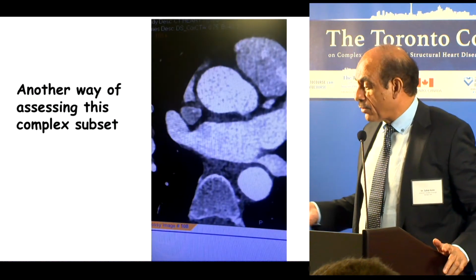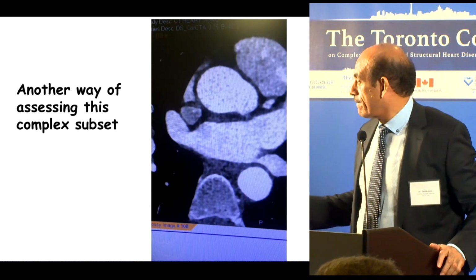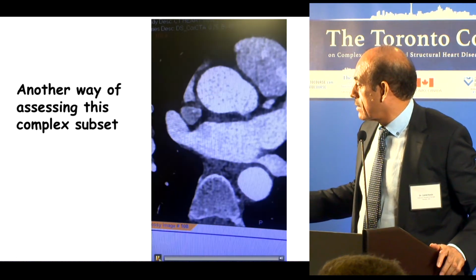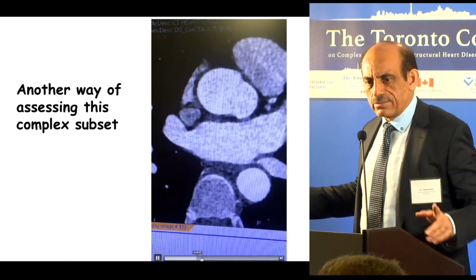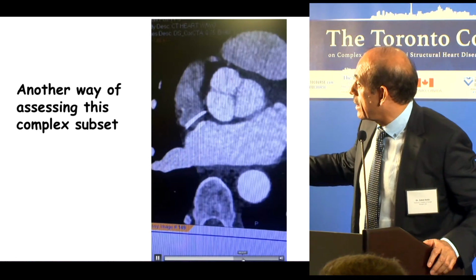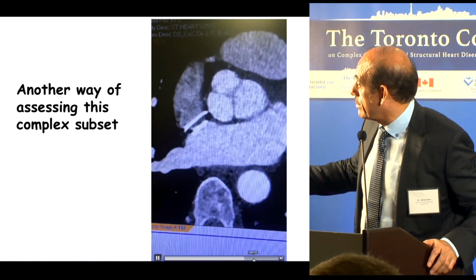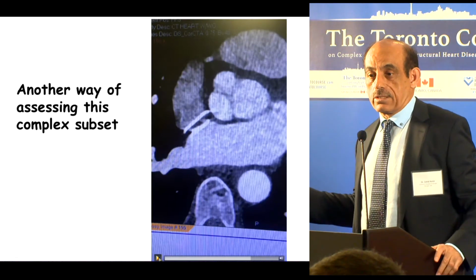So here is another way of looking at it if you want to look at it. Can you run that if you don't mind, sir? So if you will see now, you can go fast. I hope I'm not out of time still. You see here, the device is now, can you stop? That's the transverse sinus. The device is already in the transverse sinus.